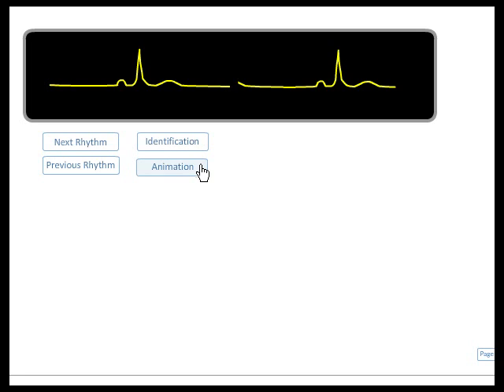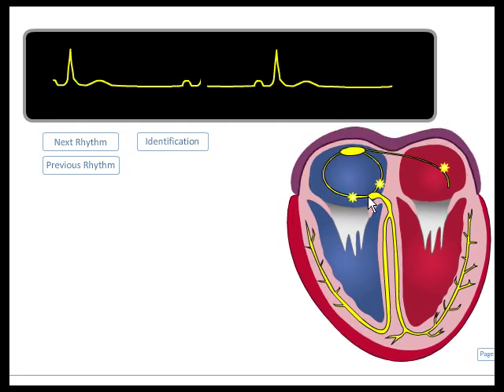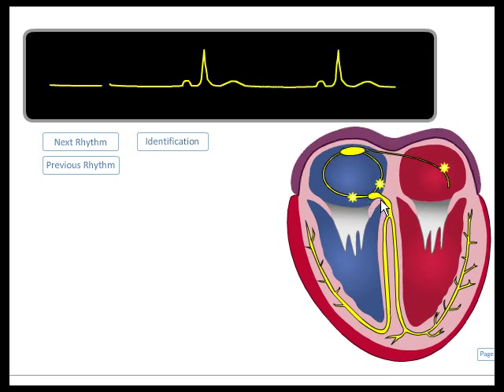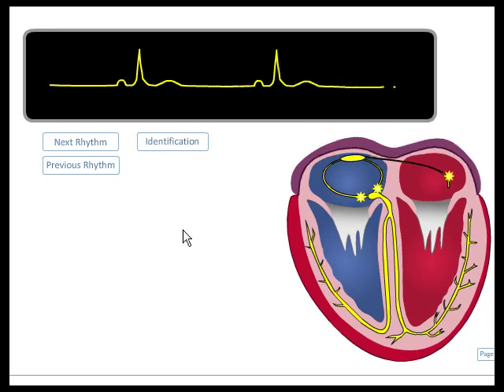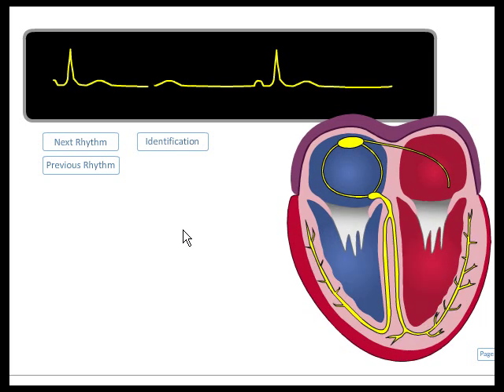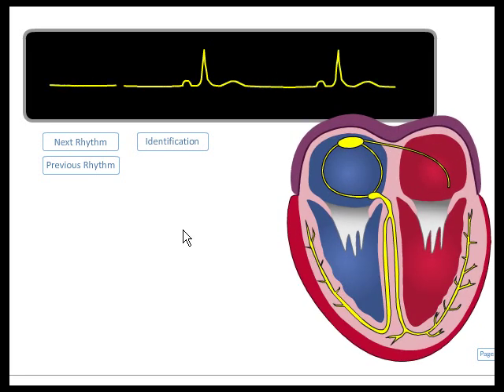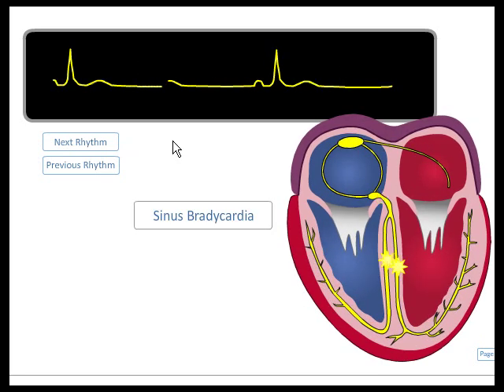If we look at the animation of this rhythm, we would see the SA node fire, the impulse travel down the intra-atrial tracks, the AV node delay the impulse, and the Purkinje fibers transmit the impulse down through the ventricles, causing rapid ventricular depolarization and contraction. This is just like regular sinus rhythm, but the rate is below 60. This is sinus bradycardia.